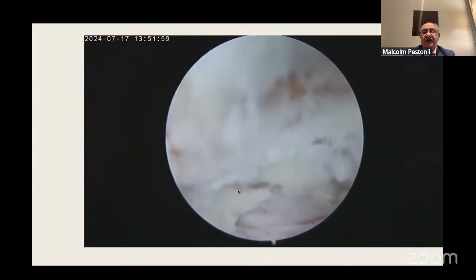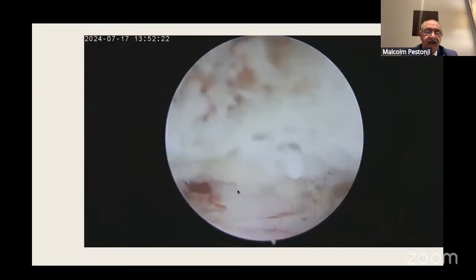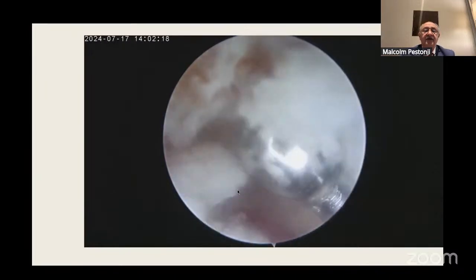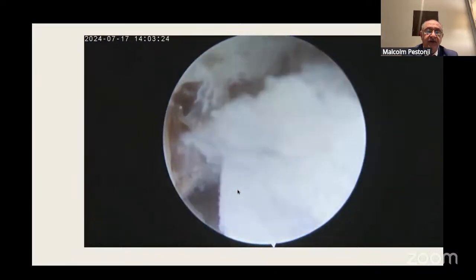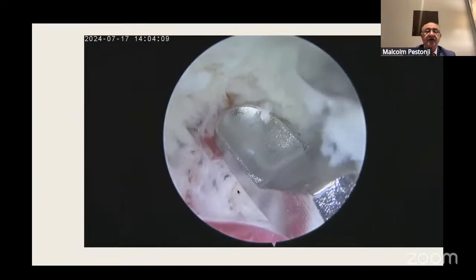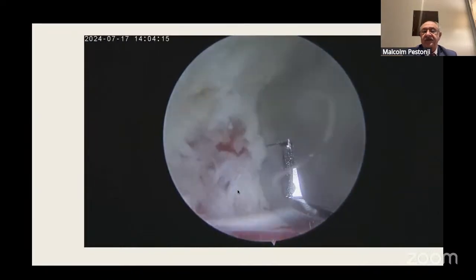You can see the calcific flavum becoming bone over here, pulling it out bit by bit, undercutting the IAP at that depth and the SAP, fracturing out all that calcific bone over there. And at the end of my journey, you will be able to see a beautiful exiting nerve root, which you can already see now. You can see the disc below, which we further burnt and pressed inwards. And you can completely open up the foramen.